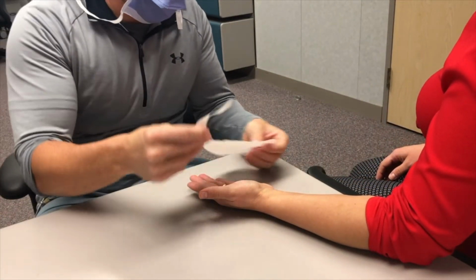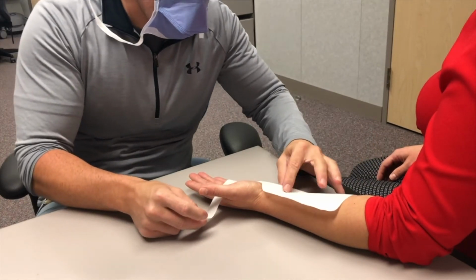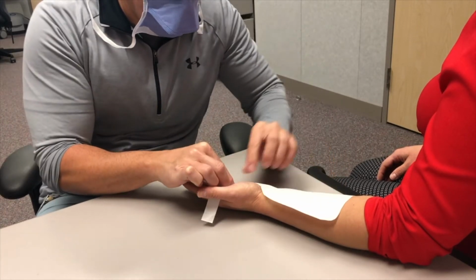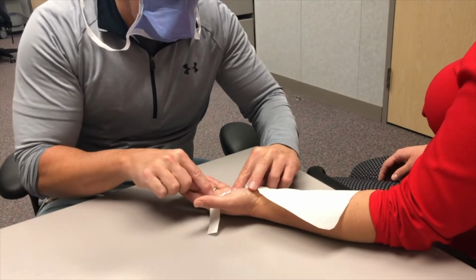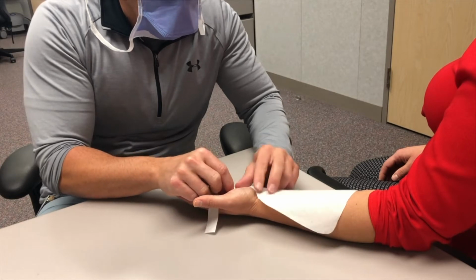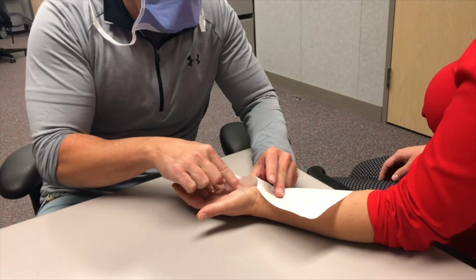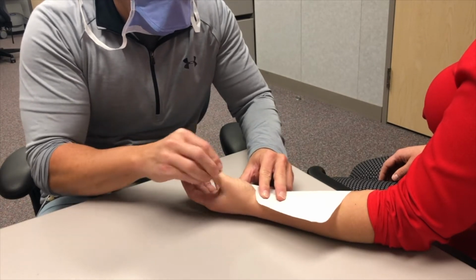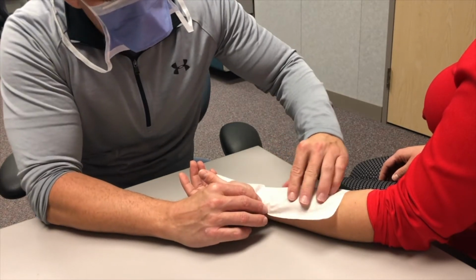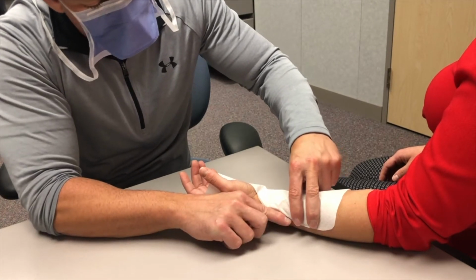After you've cut out your pattern, you want to put it back on your client just to make sure it's going to fit appropriately. Key areas to ensure are that your pattern is at the distal palmar crease, and that it clears the thenar crease, which would be here, to allow for unimpeded thumb motion. Also make sure your pattern is 2/3 up the length of the forearm, as well as 1/2 to 2/3 up the width of the forearm.